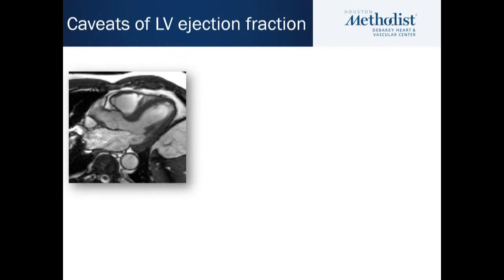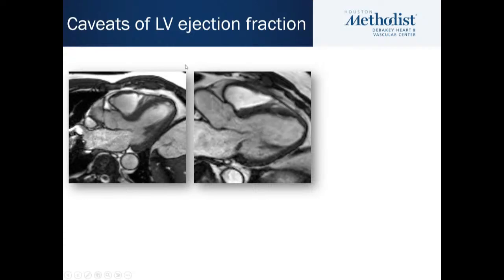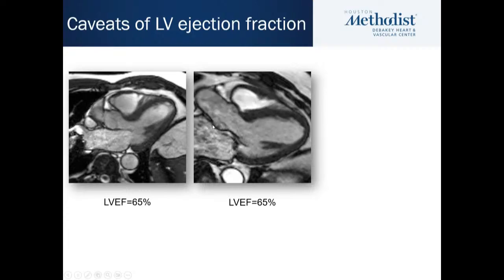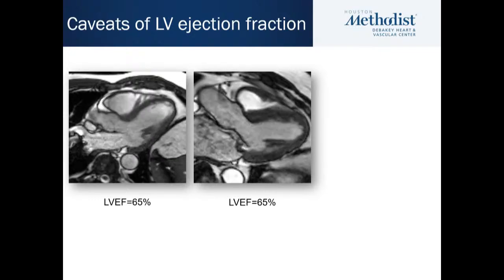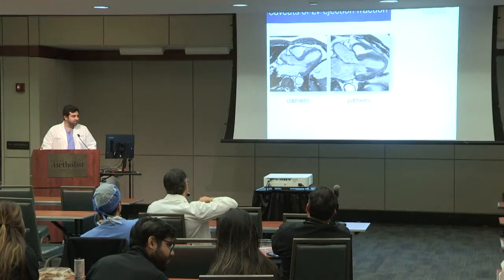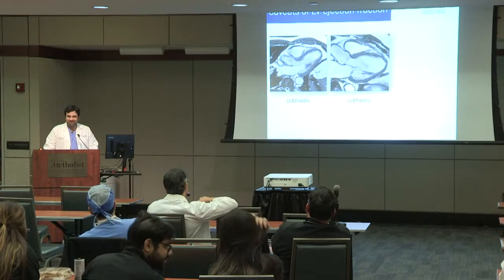Welcome. All right. So here's a person. This is actually not a patient. It's yours truly. And here's another one. We get an EF of 65% in both of them. Do you notice any differences between the two cases, for the first-year fellows in particular? And thick myocardium? This is measured within normal, actually. This is actually my own heart, so I hope it's normal. This was a scan I had 5 years ago now, probably.